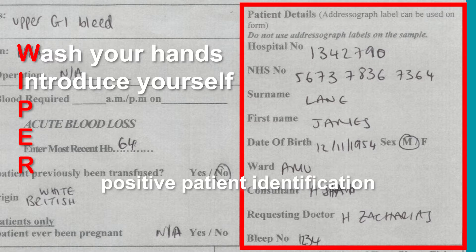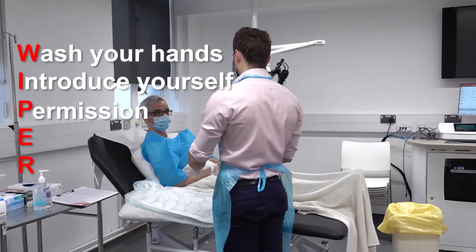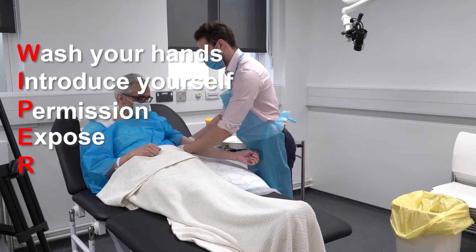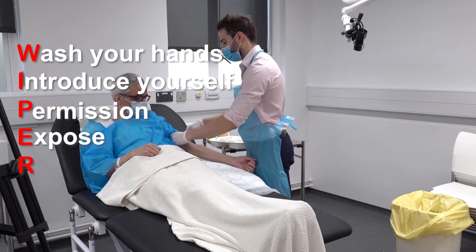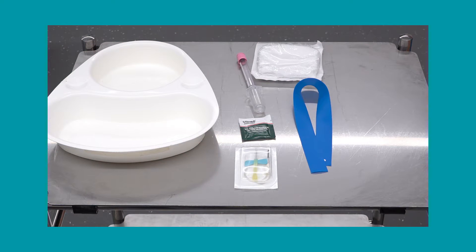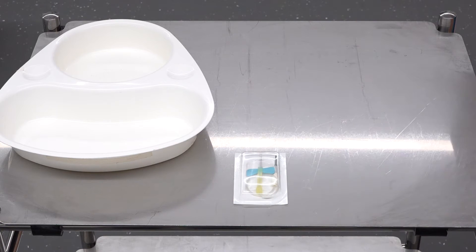If there is any discrepancy when conducting these checks, you must not proceed. Next, explain and gain permission for the procedure, checking that they understand why the blood test is required. Expose the arm and locate a suitable vein. You may choose to bring a tourniquet with you to help with this. Reposition the patient to optimise venous access. You may choose to collect your equipment before approaching the patient.